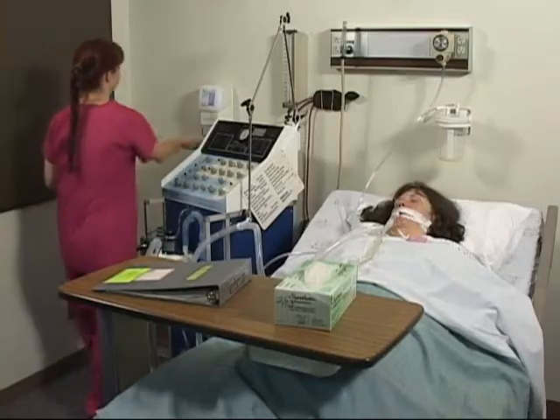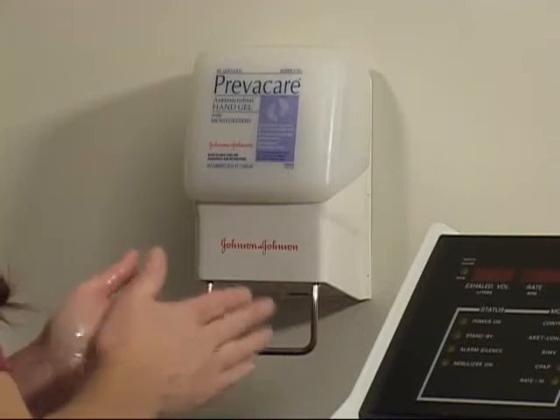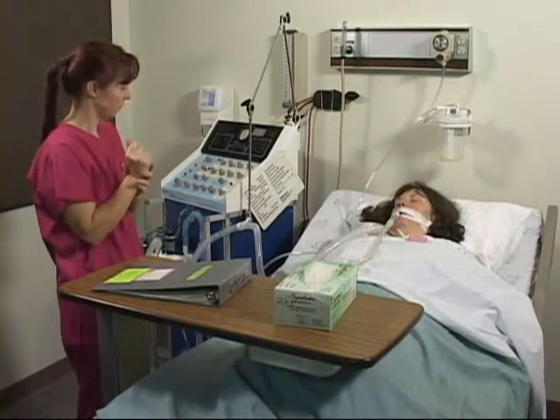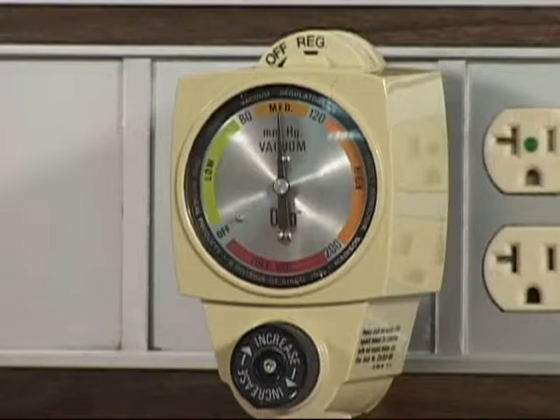Suctioning is a sterile procedure. Although the inline suction catheter is a closed system, hands should be cleansed prior to any client procedures. In this case, use of an alcohol-based rub is as satisfactory as using soap and water. Check the setting for the suction device used for this suctioning. It should be set at -80 to -120 millimeters mercury.